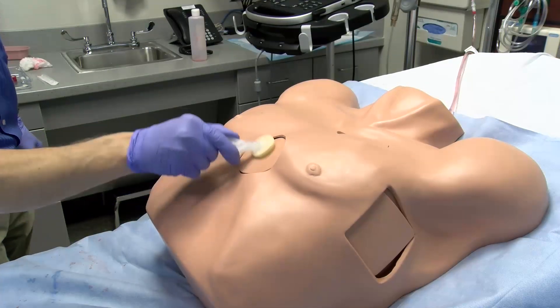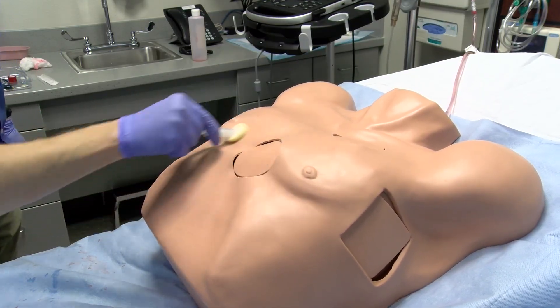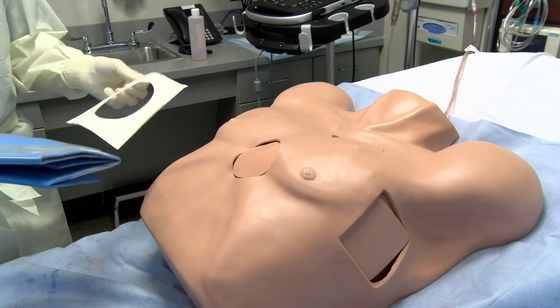Next, cleanse the subxiphoid area with chlorhexidine and place a sterile drape over the anterior portion of the patient's chest. Ensure you have washed your hands and donned a cap and sterile gown and gloves.